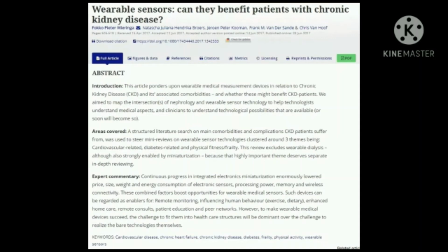Fourthly, wearables ideally should increase patients' freedom to move around and perform their normal daily routines. Instead of being limiting, the device should be robust enough to withstand being dropped on the floor, banged against a door, or getting wet in the rain.